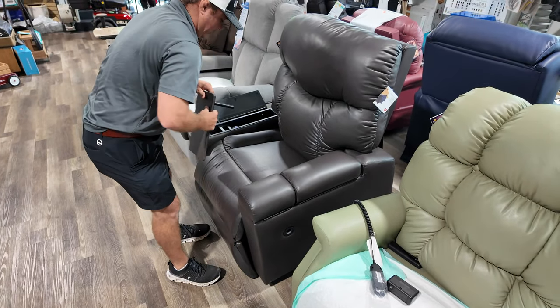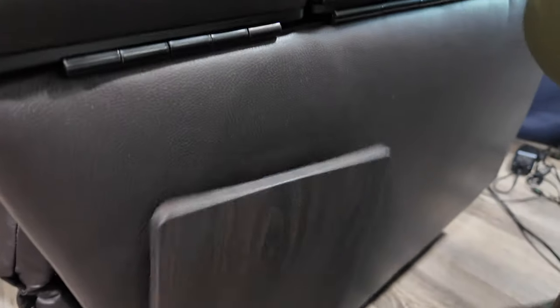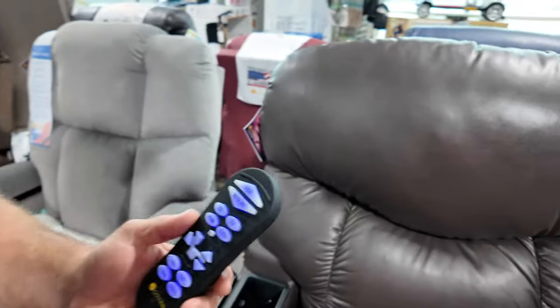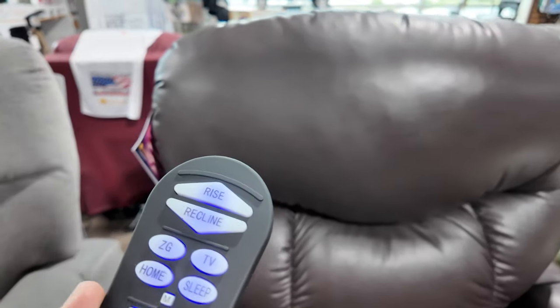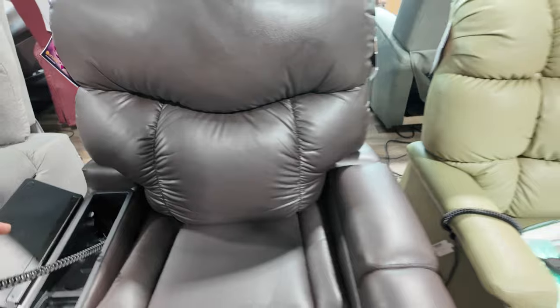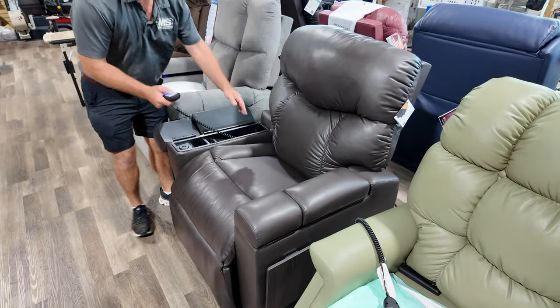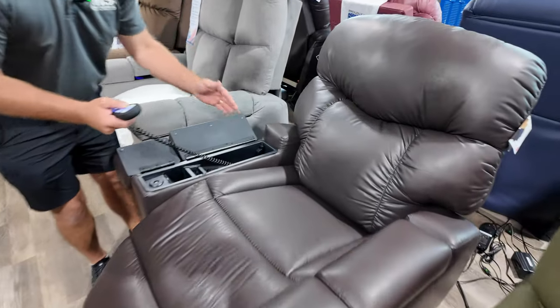This is a maxi comfort chair. Maxi comfort — we're going to talk about twilight. You can go into a zero gravity. One of the reasons behind their chairs, this is made by Golden, is less gap between the back. So this could be, if you're looking for a sleep chair and you are planning on sleeping in a chair, this is a great chair. Any chair with this design is a great chair with maxi comfort. So right now we're in zero gravity.